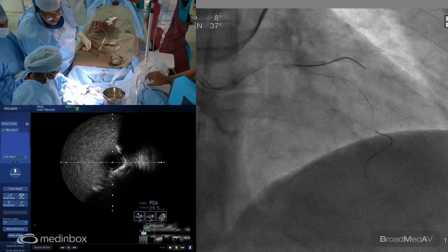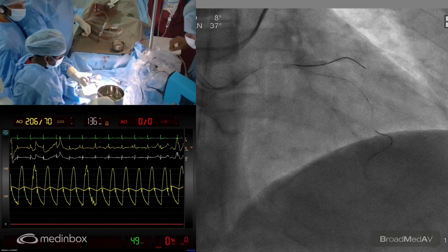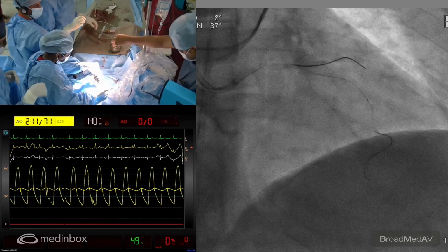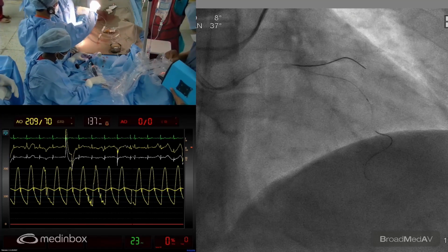Okay. Now, what we'll have to do when I say to press the power is, Ram, you need to just press on that when I tell you, okay? So I can hold till the time you say.